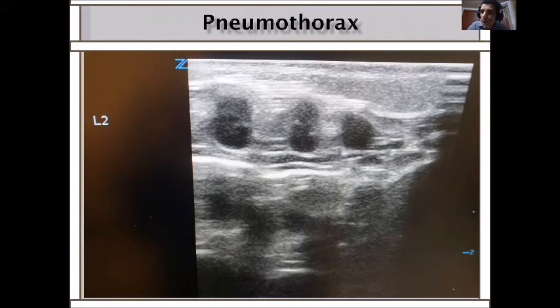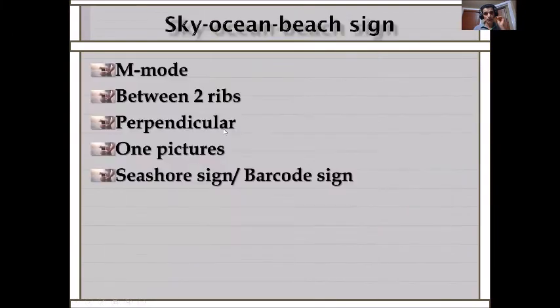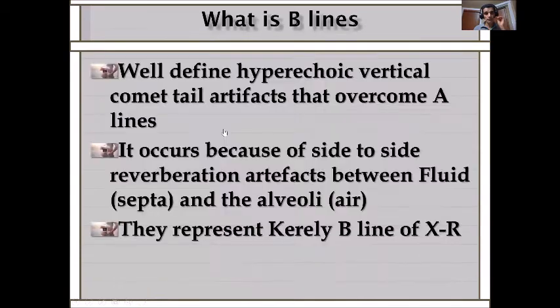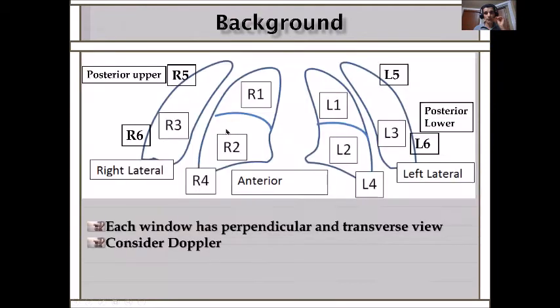How is the probe held? Is it perpendicular or horizontal? Well, we talked about it, we agreed. You can do both, but at this point, you do only the perpendicular. You are at a 90 degree angle with the ribs. Always do that. Don't do the other picture because it will confuse you at this point. So we'll repeat, because you guys seem to forget. I'm going to go back to the beginning, when we started here.